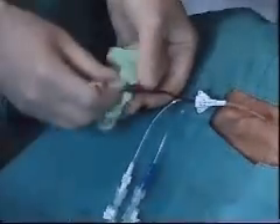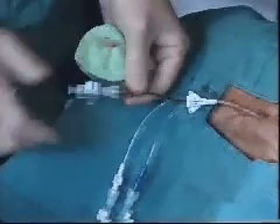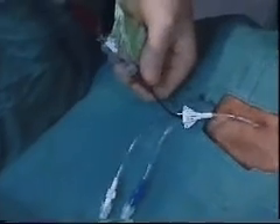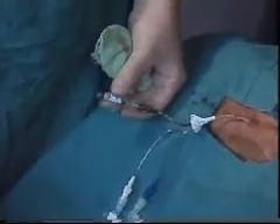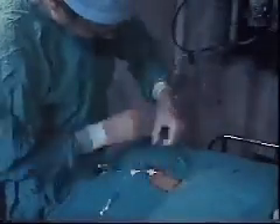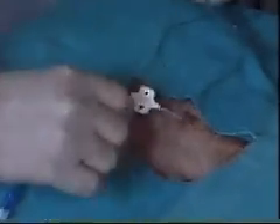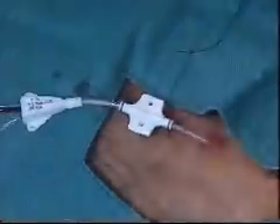The final flow switch is connected. The lumen is aspirated to reconfirm the presence of venous blood and to ensure that air is removed from the flow switch. The flow switch is turned off to close the system. Once the position of the catheter tip has been confirmed by X-ray, the catheter is firmly secured into place by suturing it to the skin. The position of the catheter is checked to ensure that the patient will be comfortable, and extra sutures can be placed to provide additional security and comfort.